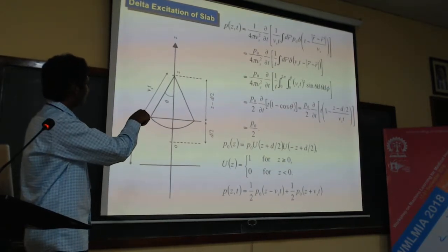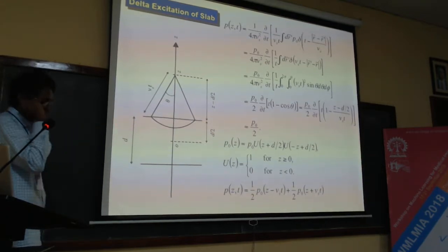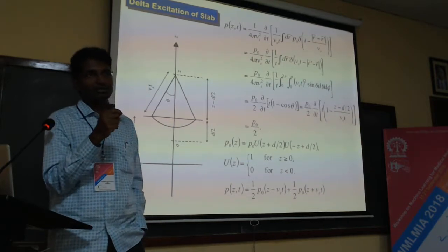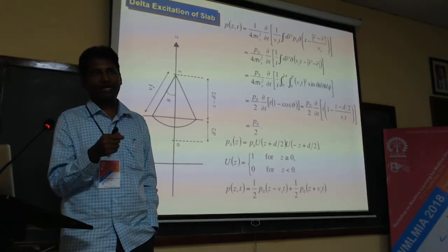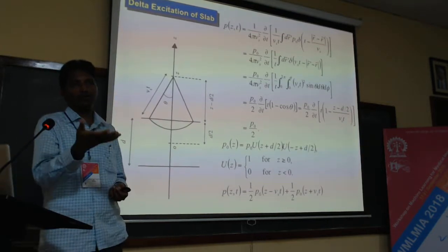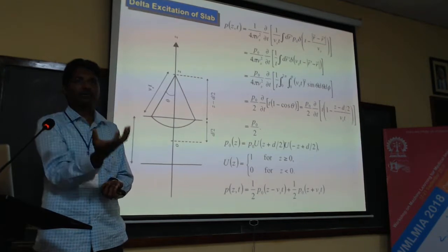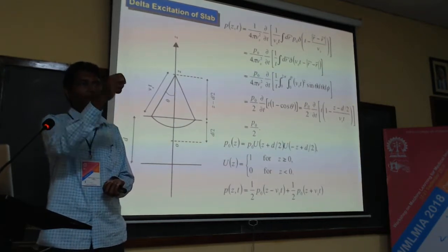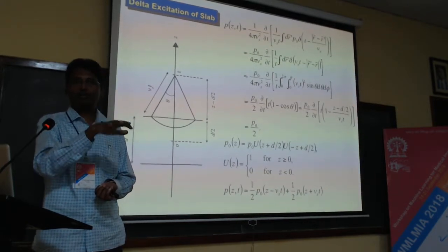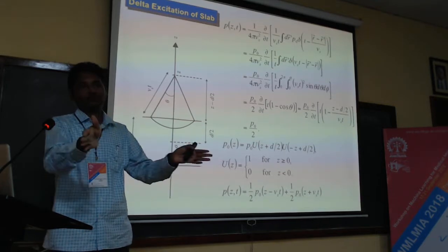Essentially, what we are trying to do is, now when we excite, there are a couple of other issues as well. One is what we are calling pulse width. The other one is, as it is propagating through the tissue, like a diffusion I was telling you. Now what happens when you put ink into a glass of water? On the top it is a drop. When you go deeper and deeper, what happens? It becomes more and more spread out. This is what we call cone expansion.